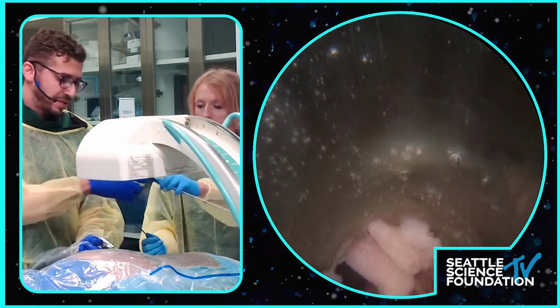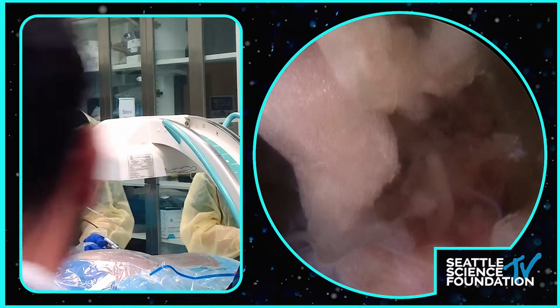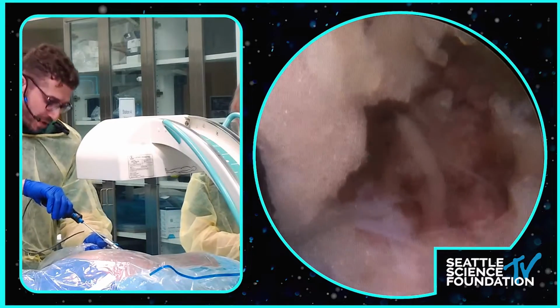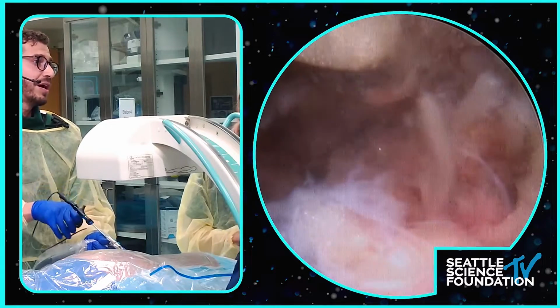So you have the bipolar, please. When you go in here, what you want to see is the junction between the pedicle and the SAP. There are two pedals here. There's a yellow one and the blue one. The yellow one is higher energy. The blue one is not.